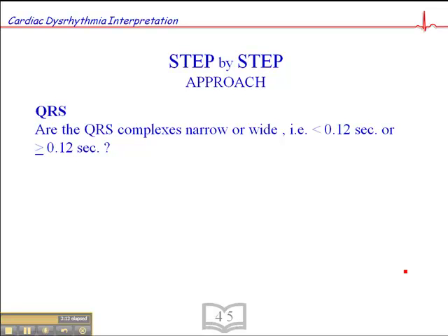Then we look at the QRS duration — not its shape, not whether it's positive or negative, just its duration. Is it less than 0.12 second, or equal to or greater than 0.12 second? Narrow or wide? If it's narrow, we know the impulse is traveling down the bundle of His and bundle branches simultaneously, which is normal. If it's wide, the impulse may be blocked in one of the bundle branches; if P-waves precede each wide QRS, it's a sinus rhythm with aberrancy. A wide QRS can also result from a ventricular focus — a single premature ventricular complex, or if the focus fires in sequence, an idioventricular rhythm or ventricular tachycardia. Drug effect and electrolyte imbalance are other causes of wide QRS complexes.